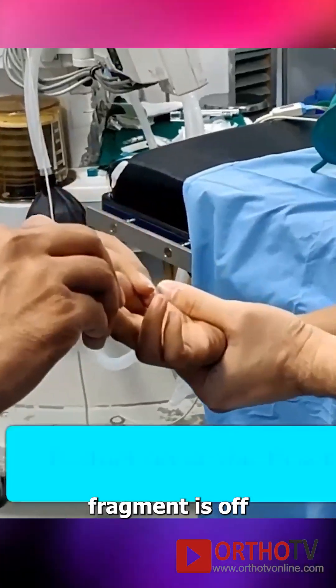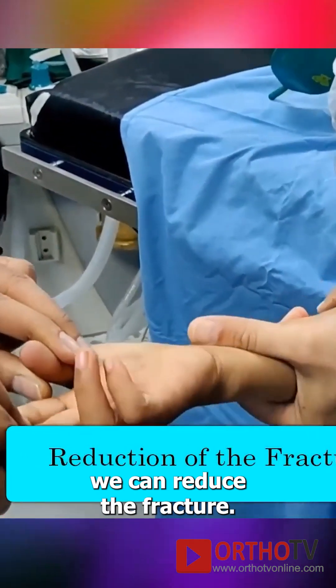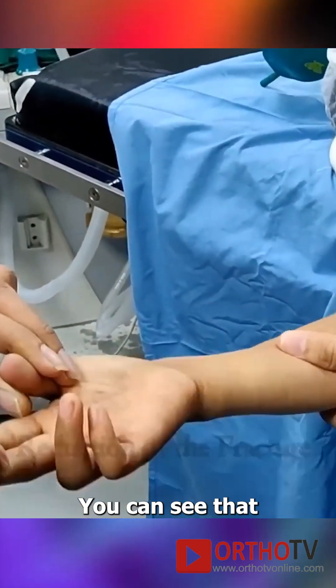The distal fragment is off the table of the board, and with a gentle milking maneuver we can reduce the fracture. You can see that pucker sign disappear.